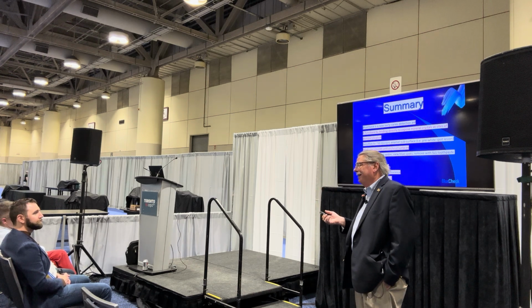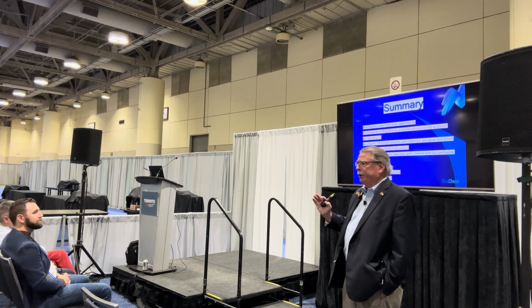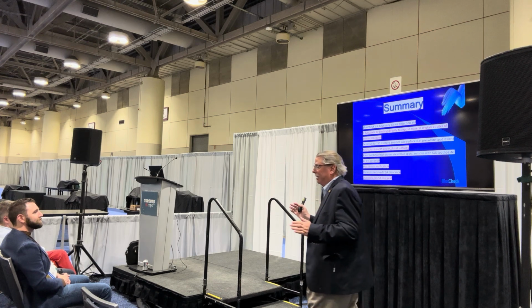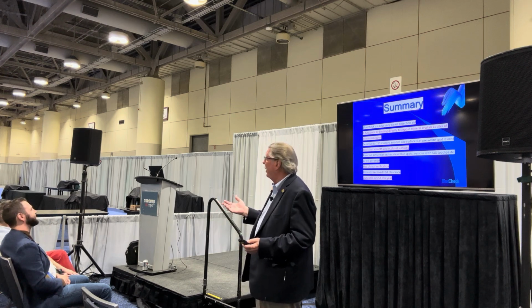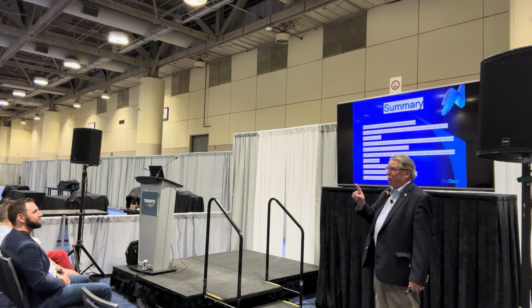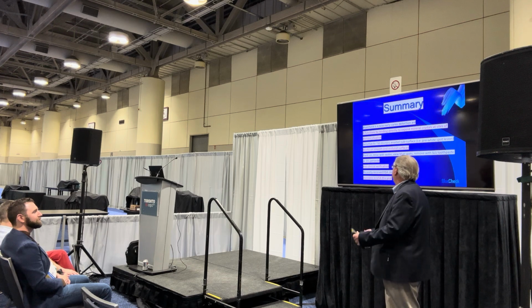And I'll tell you what I like. When parents tell me their 3-year-old's brushing is great, they're really good, I can see my dental assistant's eyes just start rolling, because they know that is the one and only time I'm getting out the red dye, the disclosure solution. And they hate it when I do that because the kid always sneezes, and then we're all polka dotted the rest of the day. But the thing is, people think their kids brush their teeth well. So I think, number one, it can show anything to a parent that's there, and it shows you too, but you might already know it. But the parent, I can guarantee you, doesn't know it. And it comes off simply, which keeps you happy and probably the parent happy.